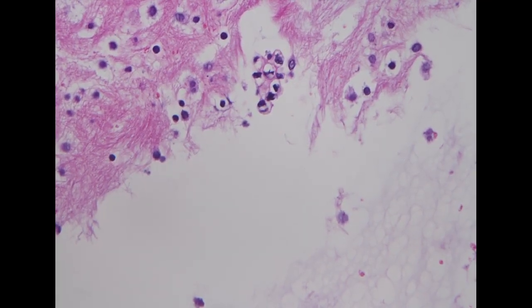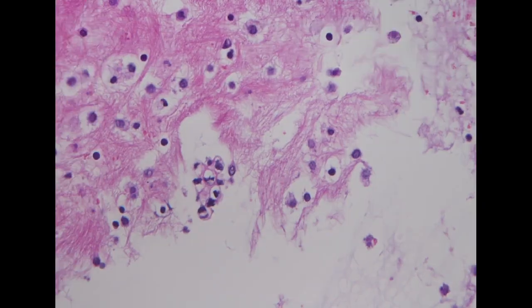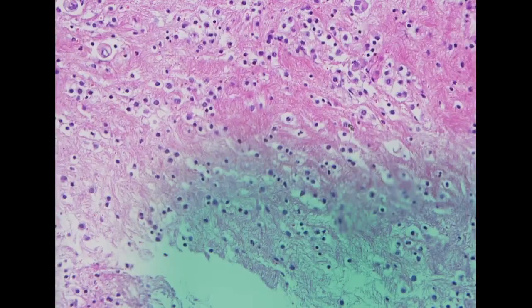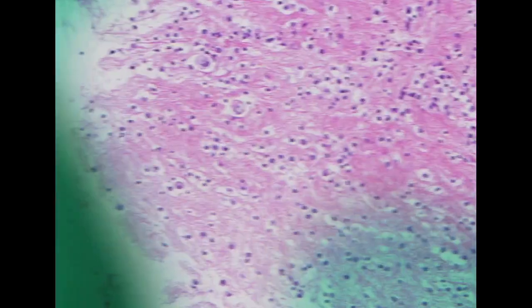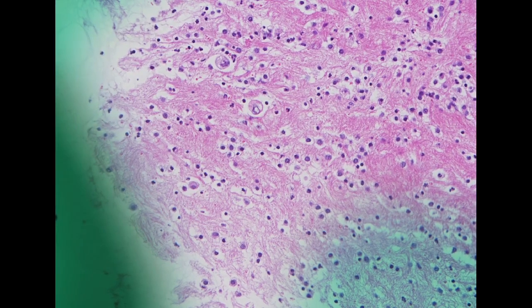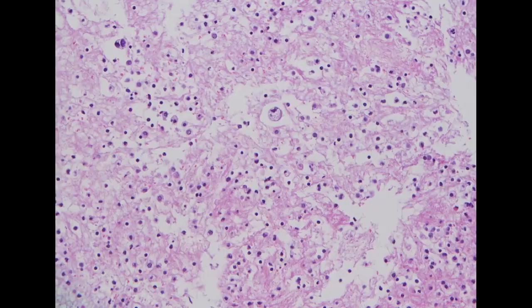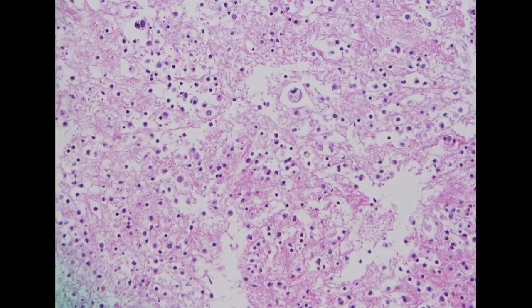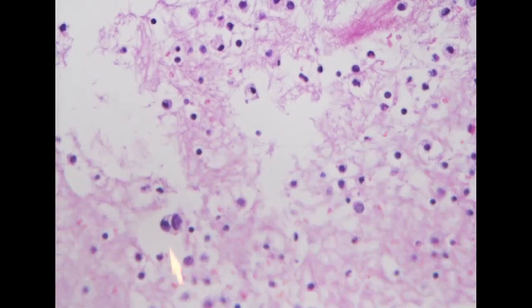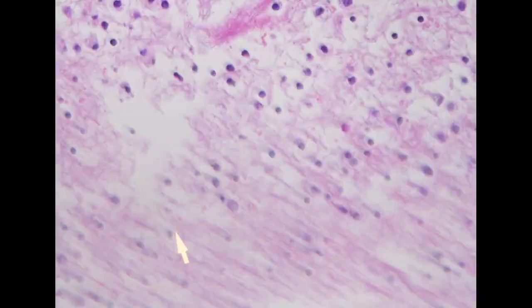Usually for pancreatic adenocarcinoma, the nuclear atypia can be quite bland. I think the case definitely has some atypical cells. It is not so many, it is very scattered. However, these features are compatible with adenocarcinoma.